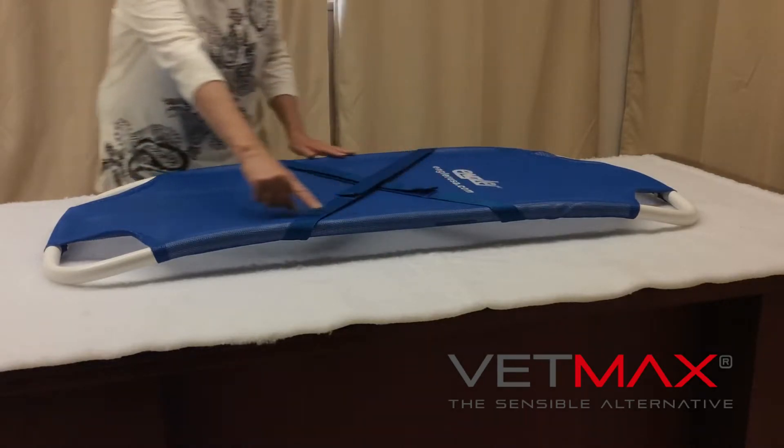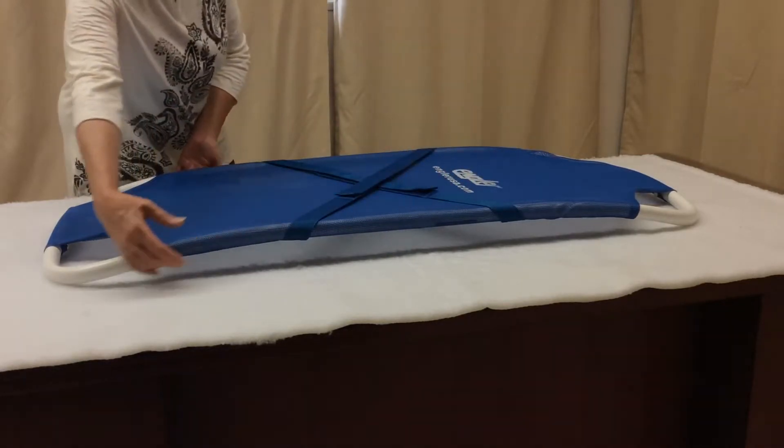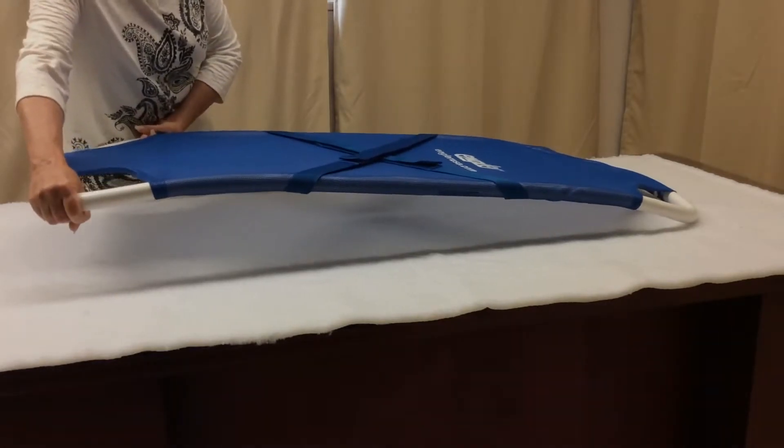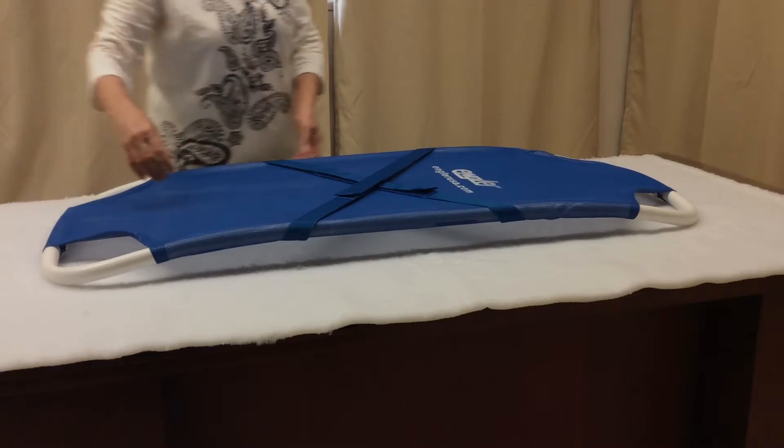The curvature of the frame allows the hand to slide underneath, providing a means of gripping the stretcher while reducing your risk of stress and low back pain.